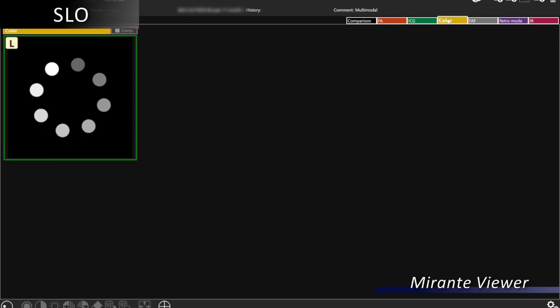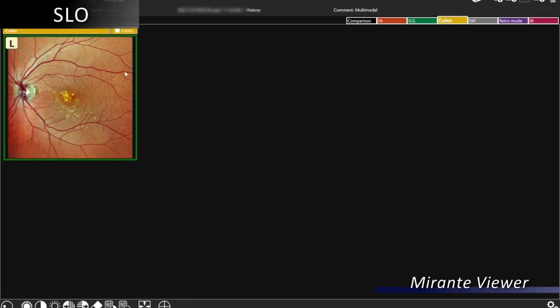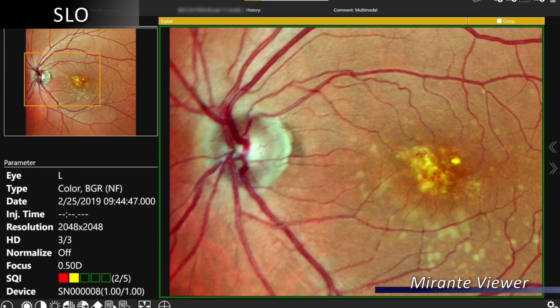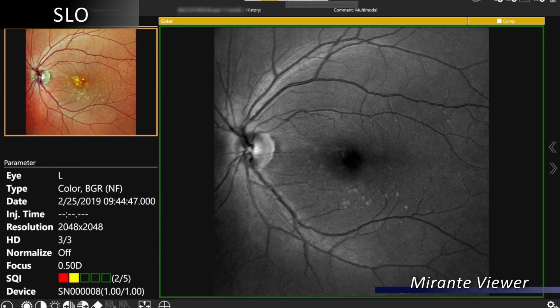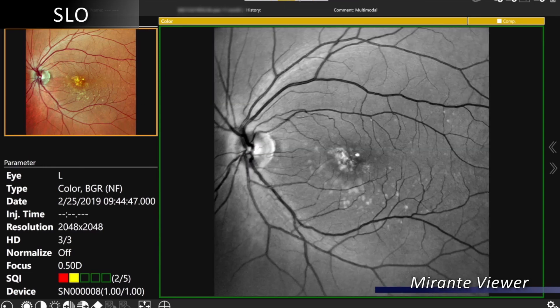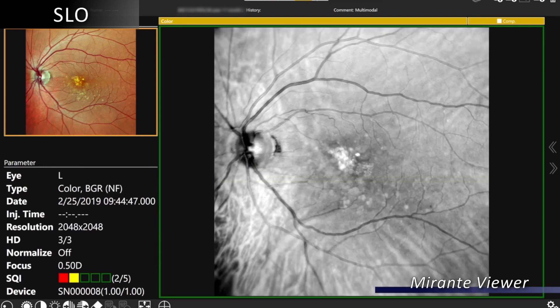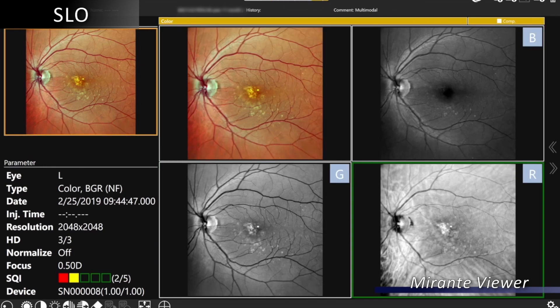By selecting the color tab, I can double-click on the high-resolution 4K image that's 89 degrees and zoom into an area of concern. Because we have three different wavelengths with sensors, we can look at the different channels such as blue, green, red, or multi, which is all four imaging.